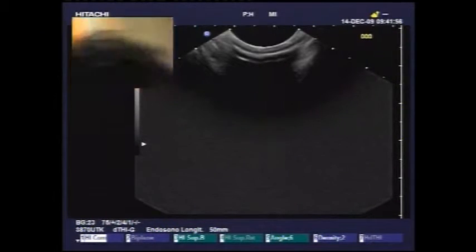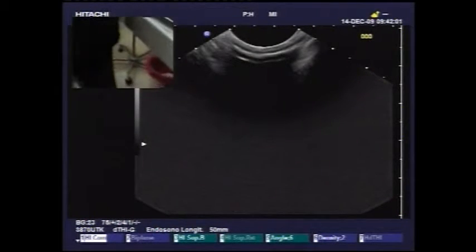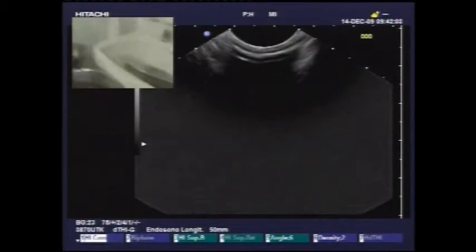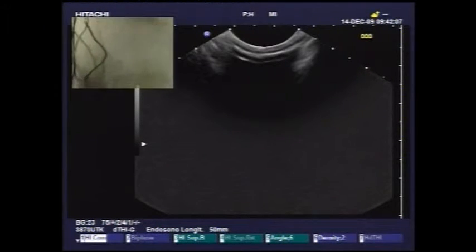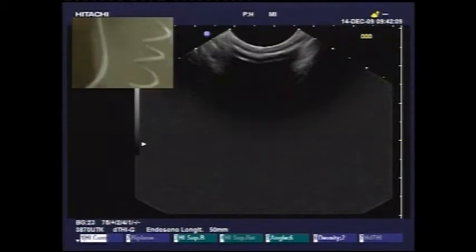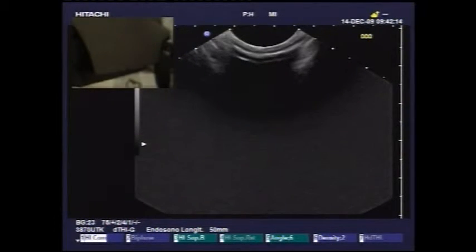Fluoroscopically, can you see the tip now? It's gone up. Can't see it clearly. Where's the tip now? The tip is at the site of the scope, in the cystic cavity. But I think your fluoroscopic images may not be good enough there to see it now.